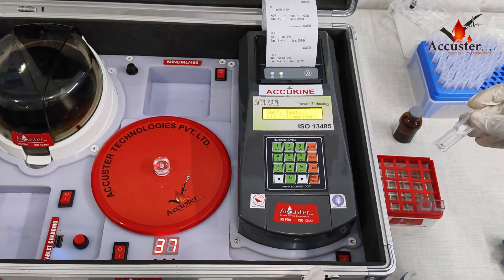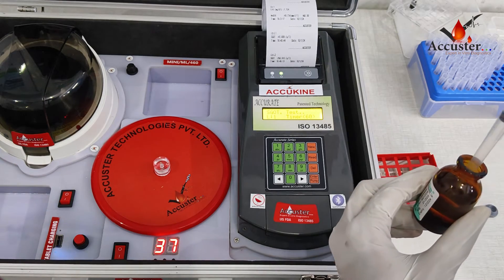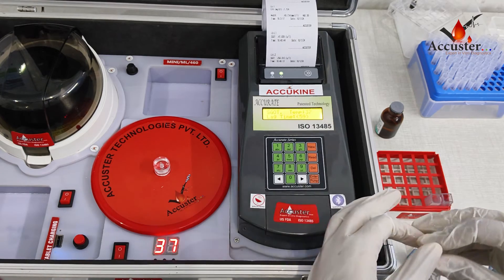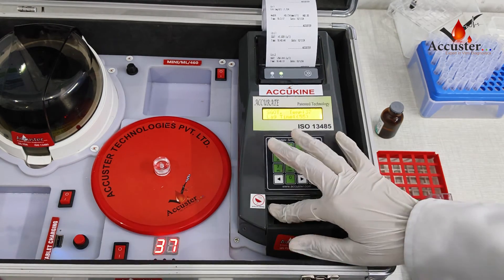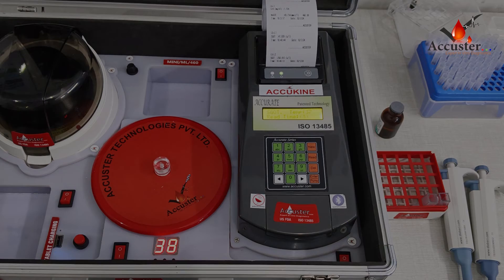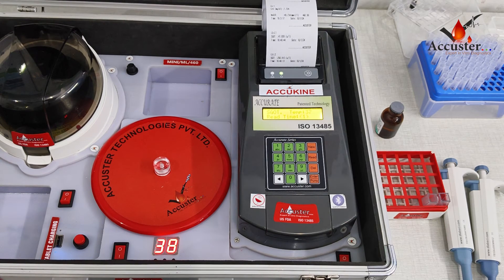Press 1. If we have to perform the test for multiple patients, we need to mark samples as level 1, 2, 3 and so on, and repeat the test process. Press the READ button to print the result for each.